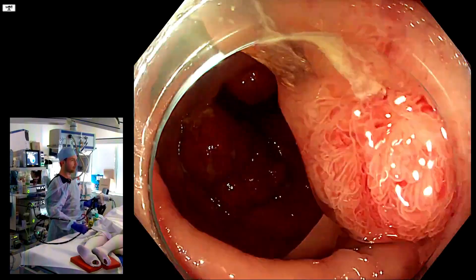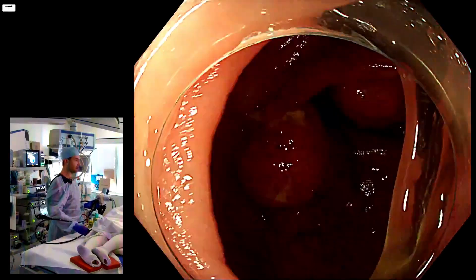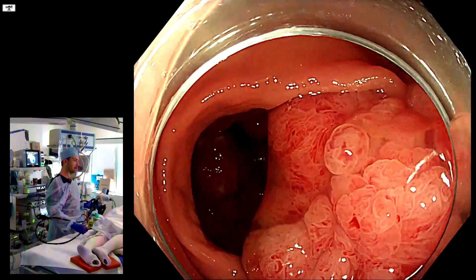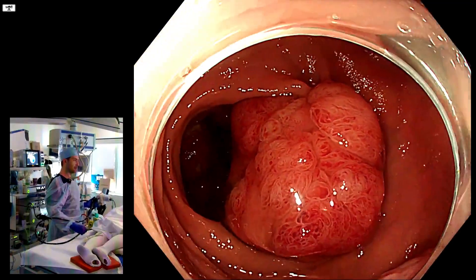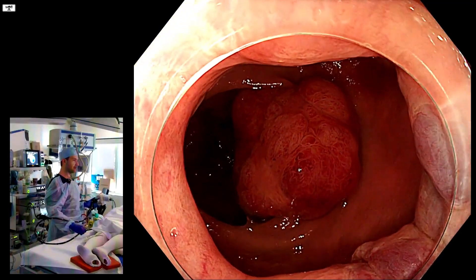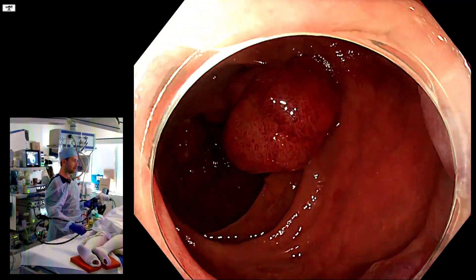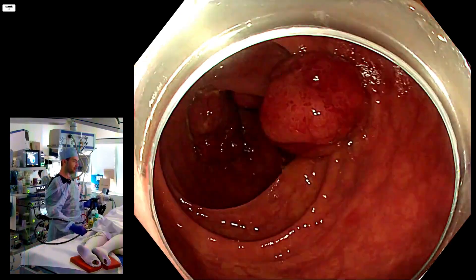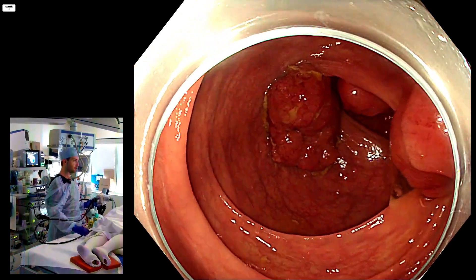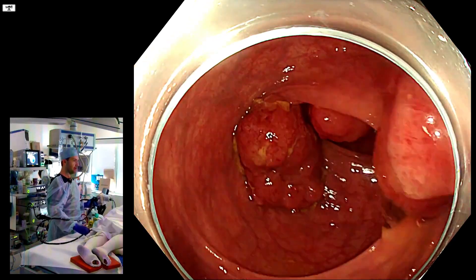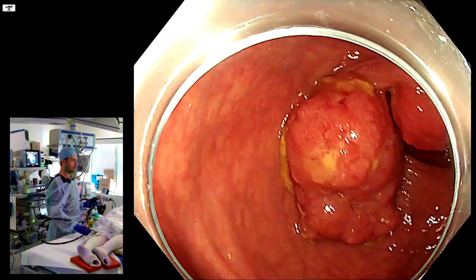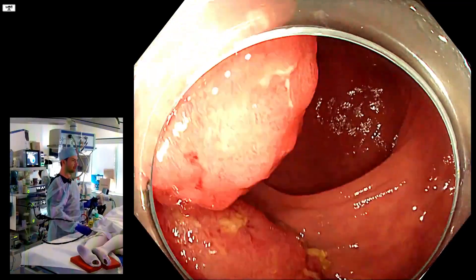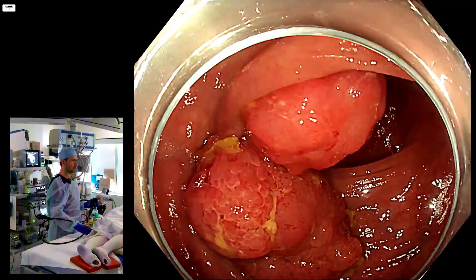I'm looking in white light at three polyps in the rectum. Come back to the anal verge always to figure out where you are on the rectum. You can clearly see the hemorrhoids, squamous columnar junction, first rectal fold here, second rectal fold where these lesions are — at the recto-sigmoid junction in the distance.